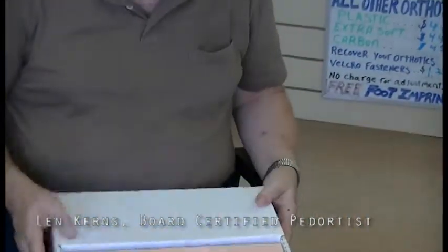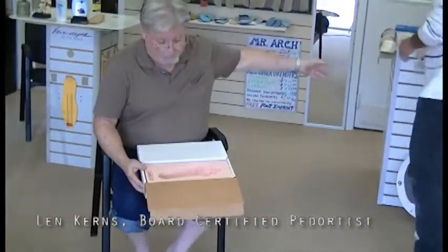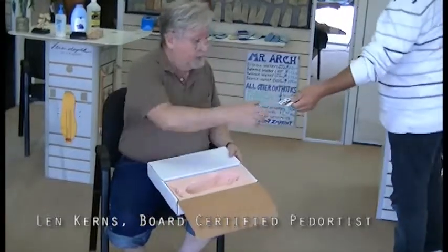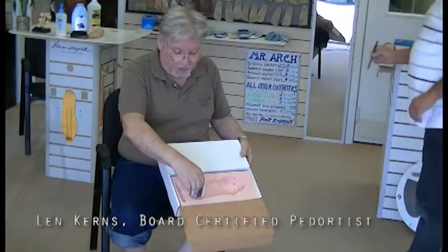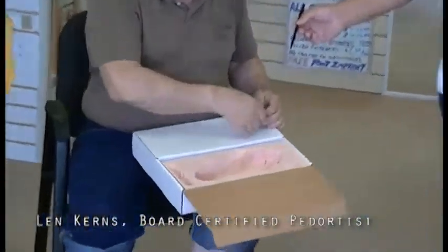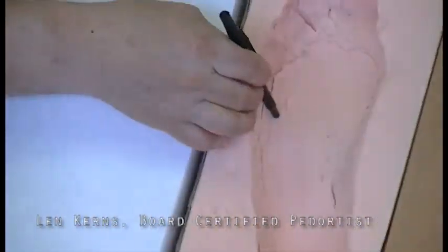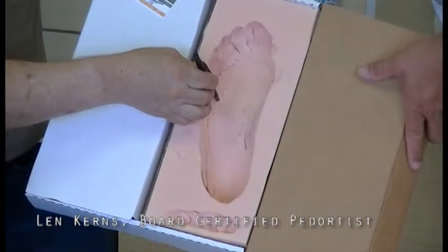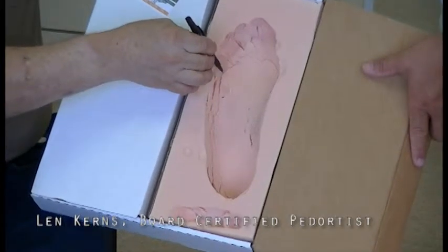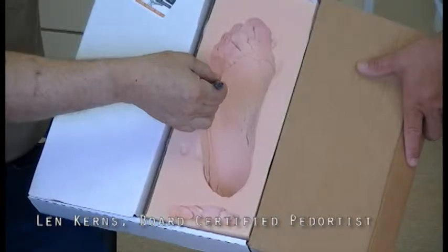And the next thing is, as soon as you do this foot, give me a business card or a pen. Here's the biggest mistake we get. Take a pen, take a pencil, put it down as you saw me in the other movies, and if you notice, Mark got the heel to the bottom of the box. It's this deep. I'm using it as a measurement. The fifth over here is the same distance down. Now, if you accidentally, while you're learning, see the pen is this high, and you're looking and the first metatarsal's about here, the patient doesn't know you made a mistake.